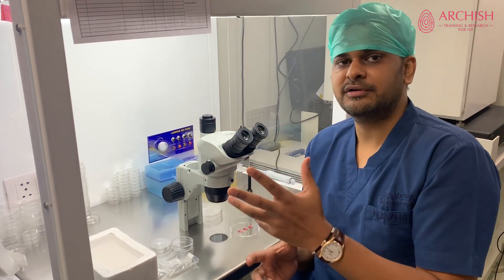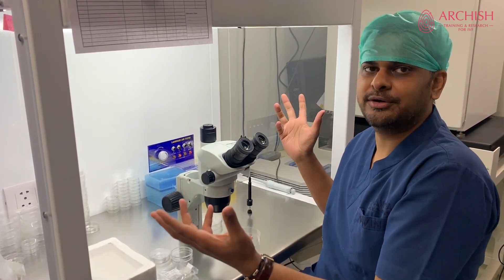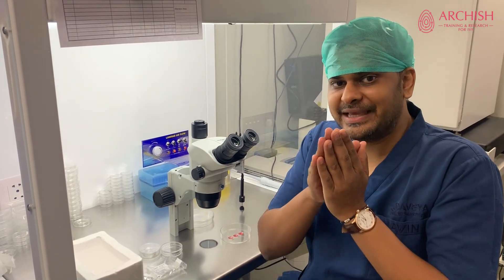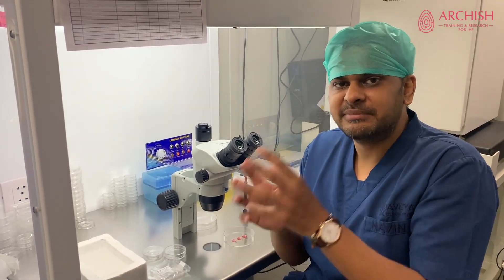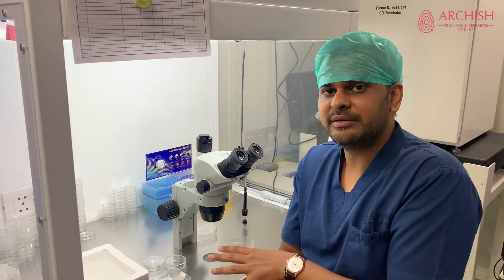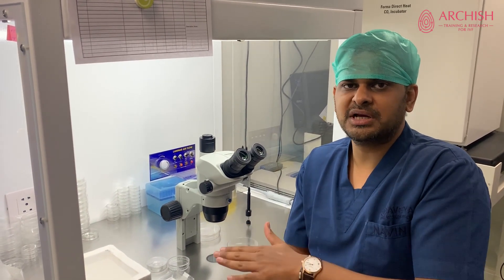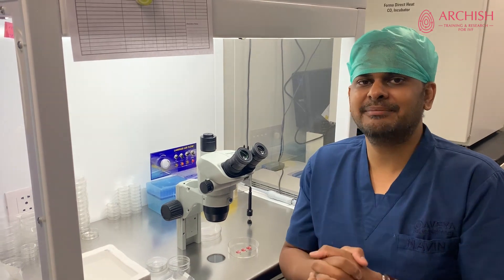For the video purpose we have a very bright tube light on. Generally the IVF laboratory doesn't have such bright lighting, and it is considered very good practice to have as dim lighting as possible. Similarly, even for vitrification, the dimmer the light the better. If there is some procedure for which the IVF laboratory lighting is turned up, cover the aliquoted media with a lid or some cover that obstructs the light, to ensure maximum output from the vitrification process.